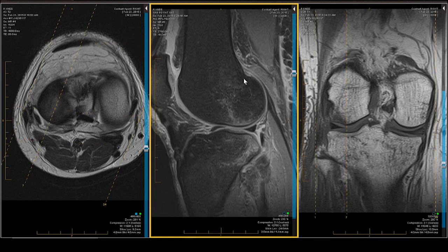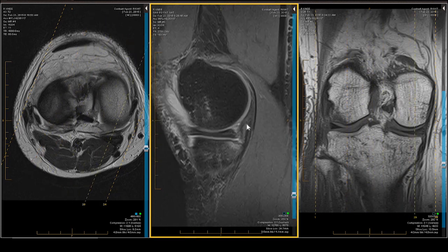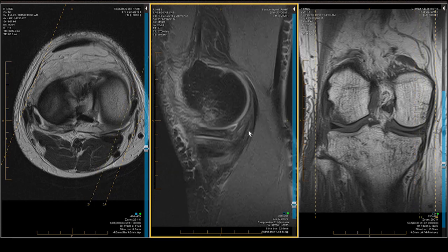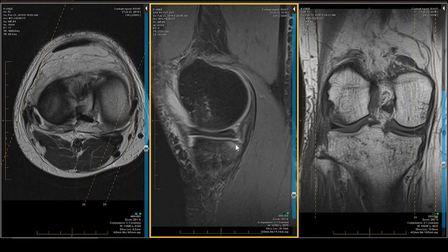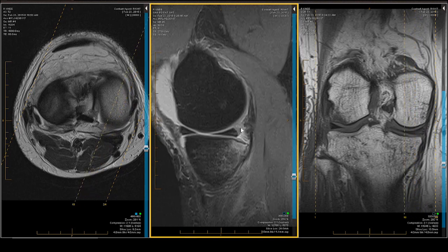Let's bring up the sagittal projection and blow it up a little. Going to the less-affected corner first — the posteromedial corner — you can see a small fracture, some cortical disruption, a little bit of depression, and the semimembranosus is still inserting. There is a little swelling at the meniscocapsular junction, which is part of the corner.